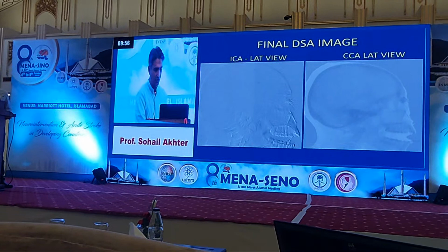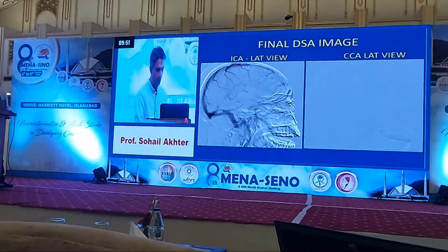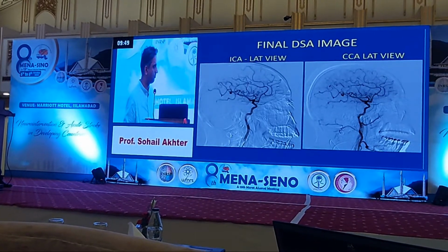So the final angiogram reveals the percutaneous embolization performed through butterfly needle shows complete obliteration of the malformation in this case.